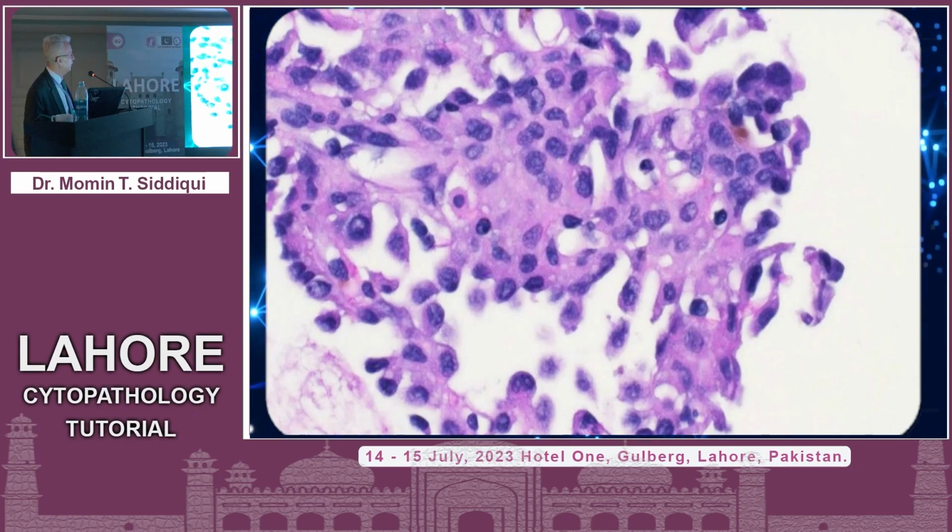Okay, take a look here, but take a look at the periphery here. I mean, there is a very subtle hint here that some of these cells are a little different from the ones present in the center there.